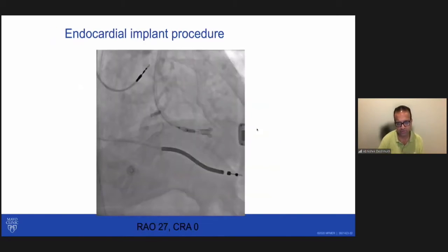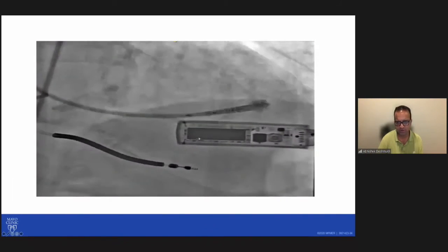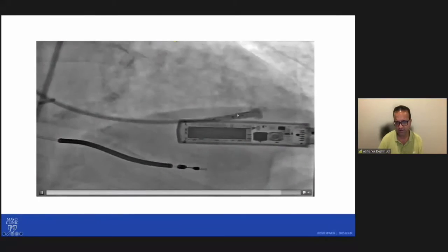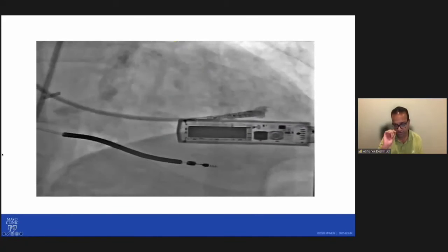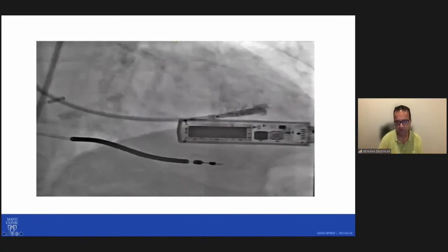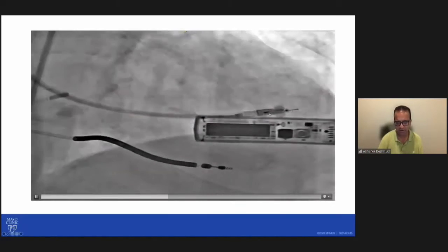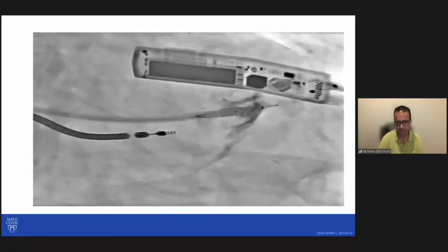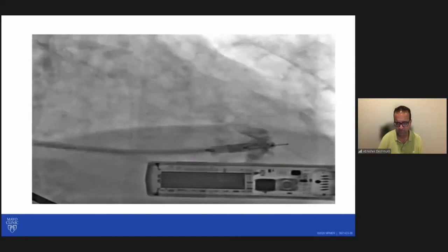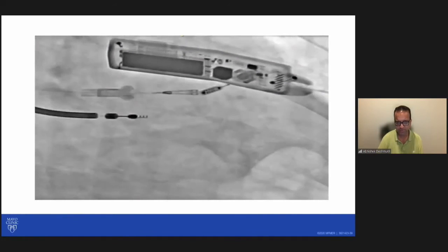Day 2 of the procedure is to implant this electrode in the left ventricle, and it can be done either by a retrograde approach or a transseptal approach. This is a 12 French delivery system, which has an 8 French catheter in it with a balloon. This small part is the electrode. And through contrast injection, we are trying to see whether we have contact with the LV endocardium, inflate the balloon, and deliver this electrode in the LV endocardium after making sure there is enough tenting, and certainly contrast can help in that. And once that position is noted, you can disengage the delivery system and this electrode is deployed.